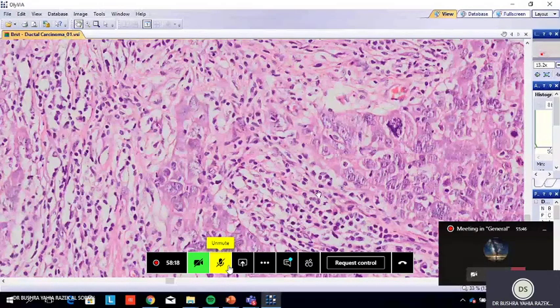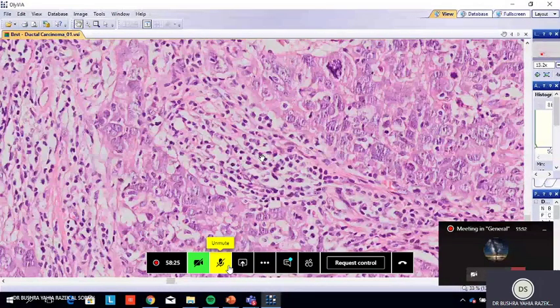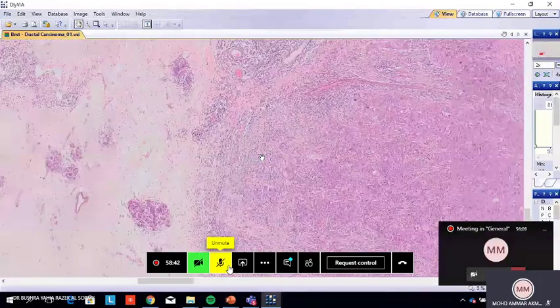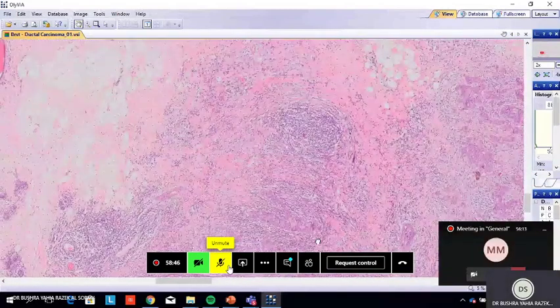Desmoplastic reaction means there is a lot of inflammatory cells there, and also reaction. This inflammation will be replaced by fibrous tissue. And remember, the nipple is retracted. Why? Because of this inflammation, reaction. That's fibrosis. Okay. Any question?